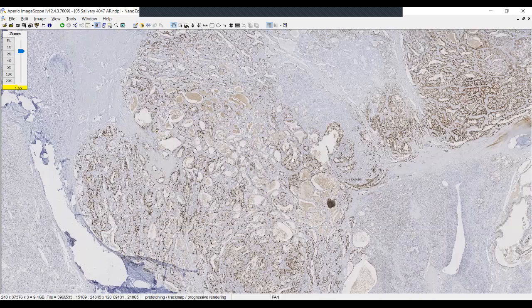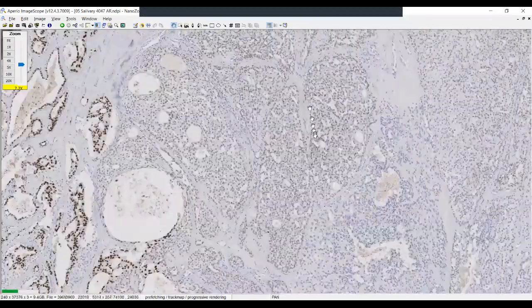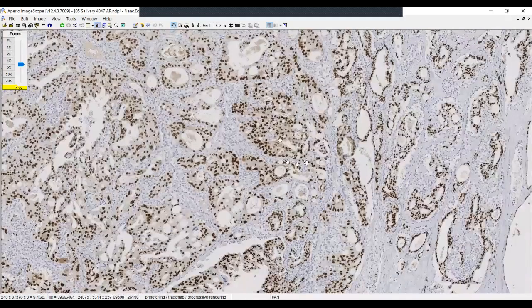There were several other areas in this case that showed invasive growth out into the periphery, because sometimes if you look at an area like this, you'll say, wow, here's still part of that benign pleomorphic adenoma. So how do you know if it's still an in situ component? Is it just the area of apocrine change?